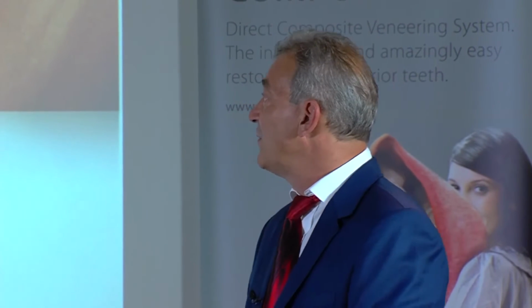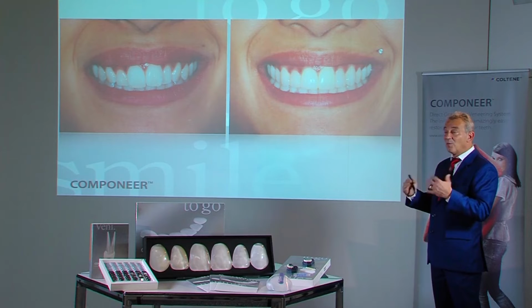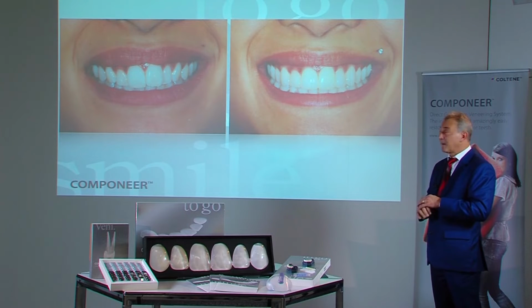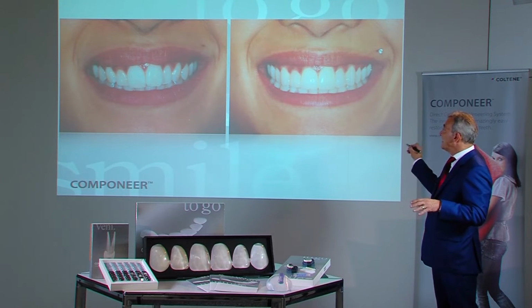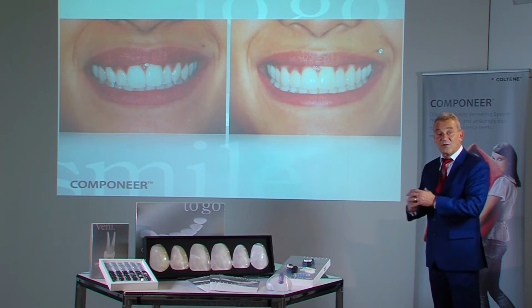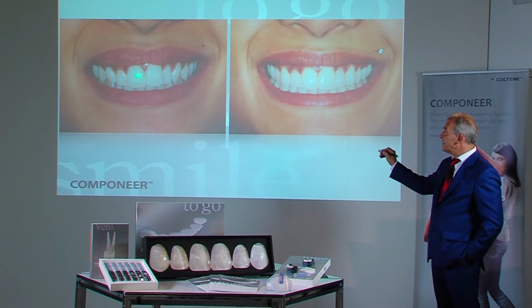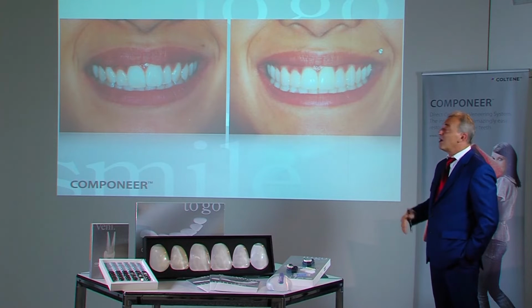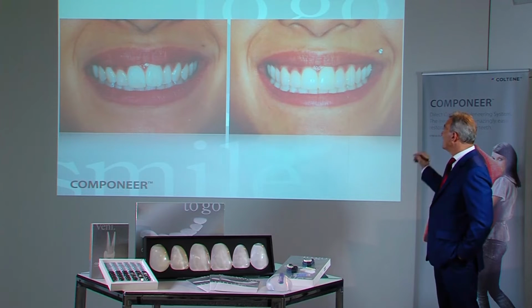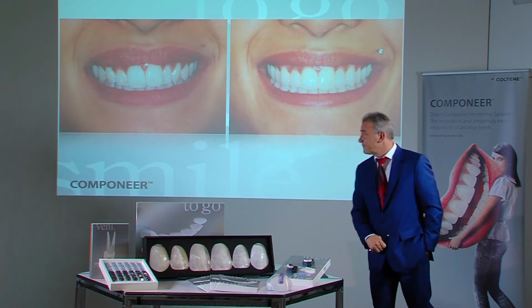Is it fine the way it is, or do I need to reduce the surface a bit more to harmonize the dental arch? In this case, everything is fine as we had to come slightly forward with the lateral incisors to compensate for the position of the central incisors. We did not want to grind off too much from the central incisors, and this completes the rounding of the dental arch.